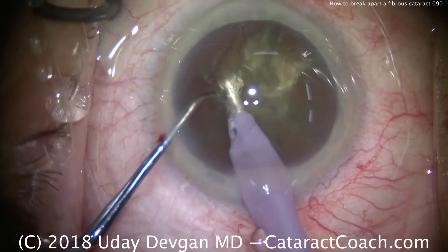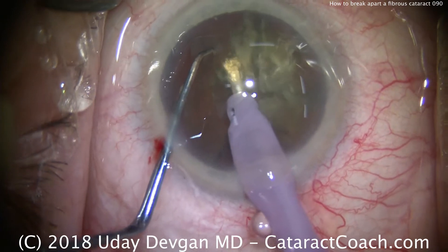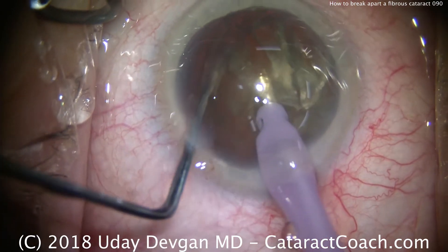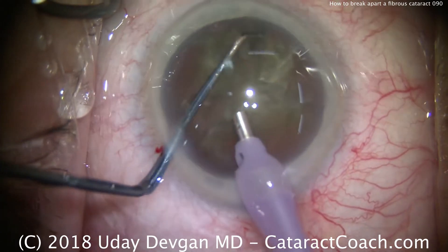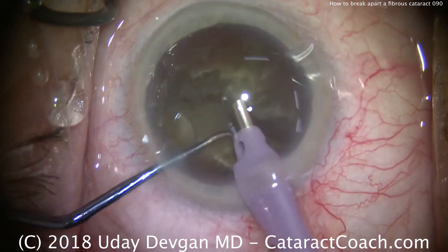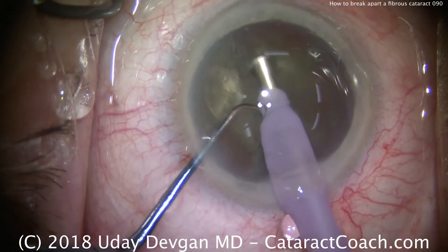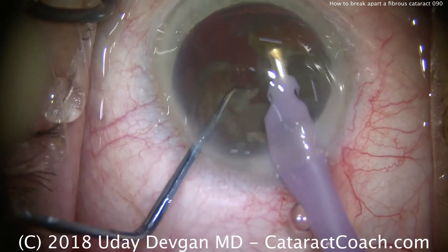Rotate again. Get a good purchase — high vacuum — get the chopper around. Now I think we finally have a piece that's reasonably mobile, but it didn't come up. Rotate again. So that's our technique: rotate chop, rotate chop, again and again. That'll help break down the nucleus.